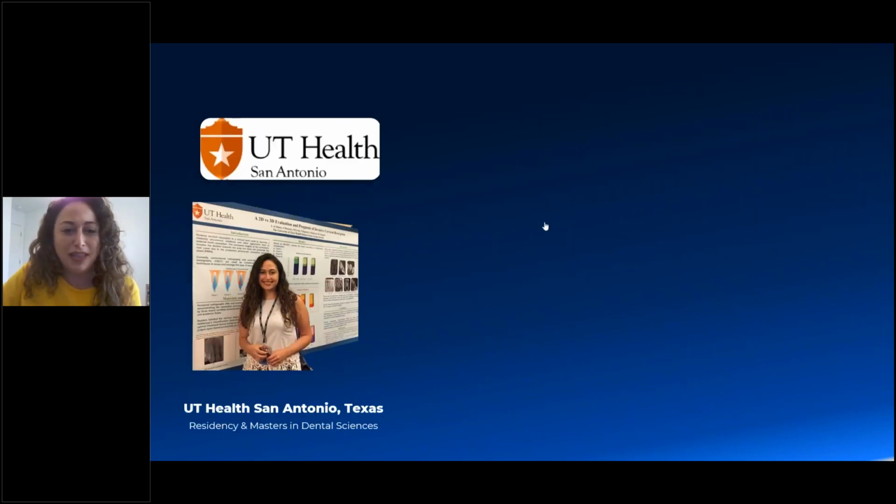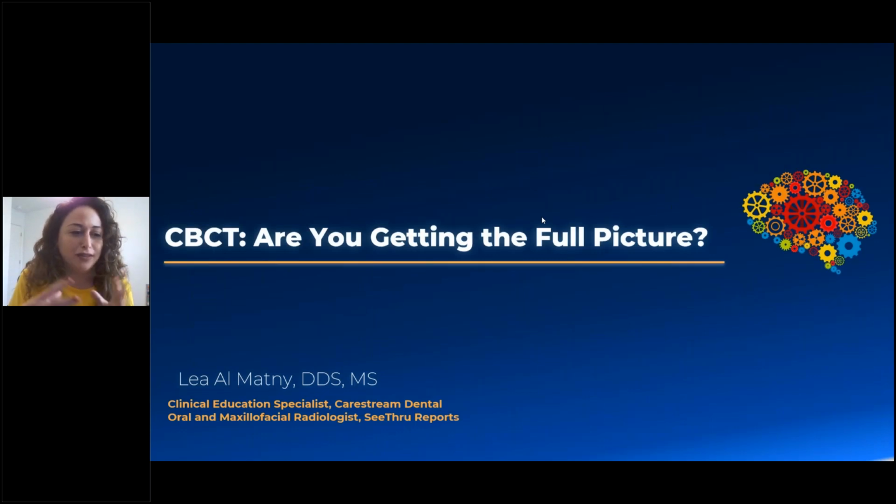Usually, whenever we think of cone beam CT, we think of using it just for a specific procedure. So what I'm hoping to go through in the next 90 minutes is really to talk about the different usages of 3D beyond just treatment planning.